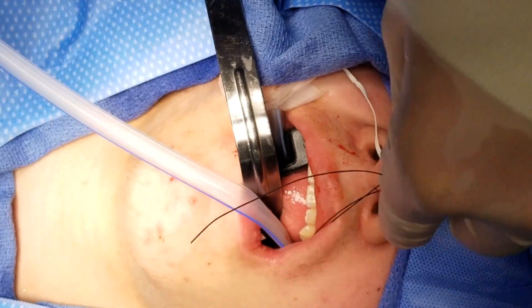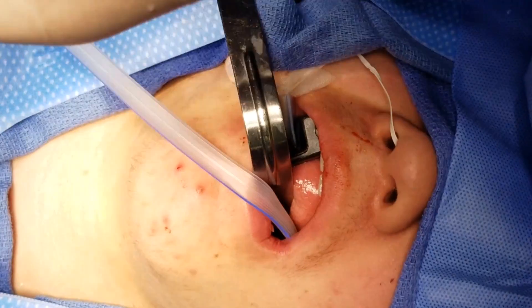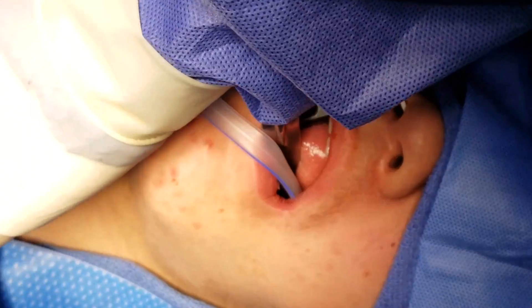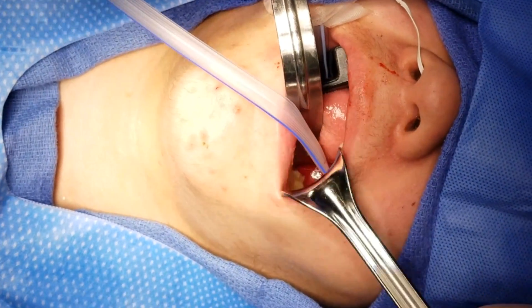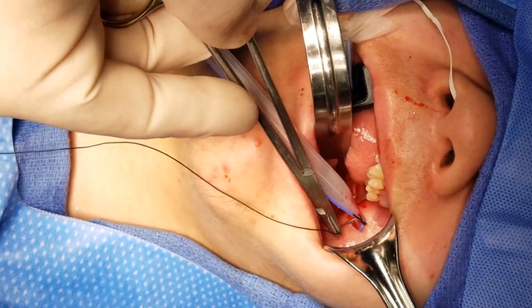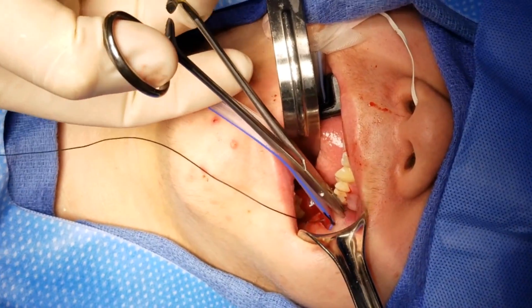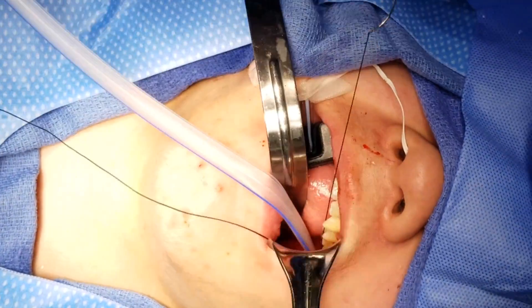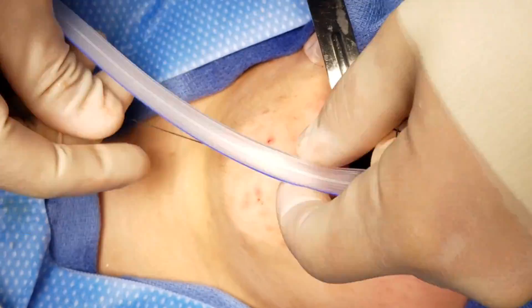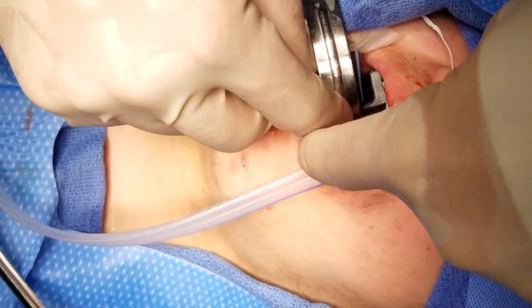It's just I'm not used to the latex-free ones. Stitch? Or suture on there? Scissor? I'll get it here in a moment. Okay, we'll sneak back in here. We don't usually use quite such a large retractor, but for filming purposes, we will. And I'm going to cut this one off, and I'm going to put another one in a slightly different position, and then we're done. Can I get a little stuff on the SH, please? Thank you.